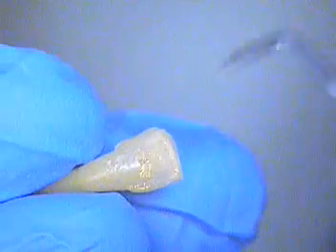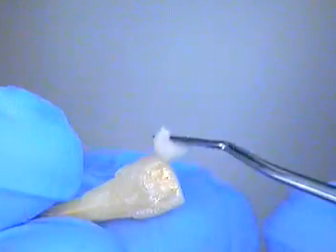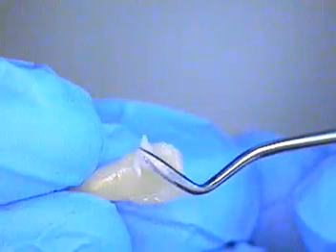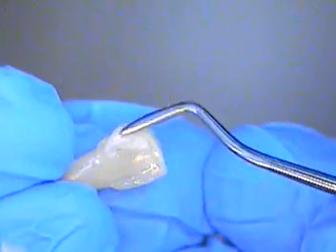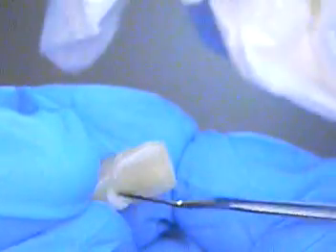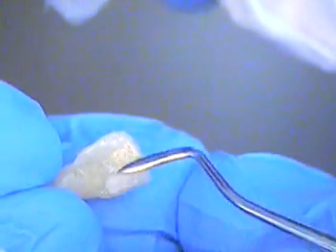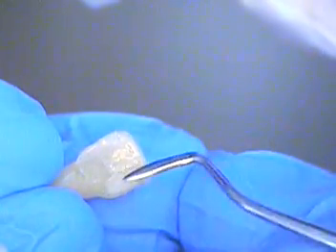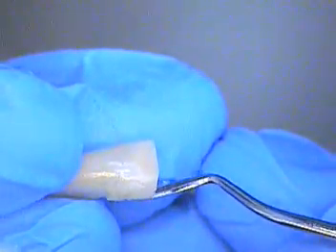Let me just power up on the magnification. We are going in interprox — we want to kind of give the illusion that we still have tooth structure to look at. That's a little too much; I'll take a little of that off. This is the lingual of the tooth, so I'm just adding this to give an effect — an illusion, if you will. Kind of a chameleon effect. That's a little better. I like it.